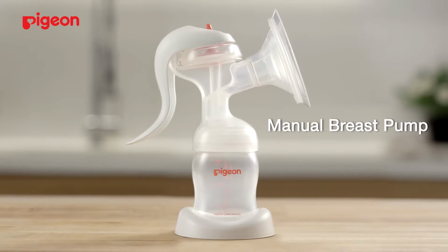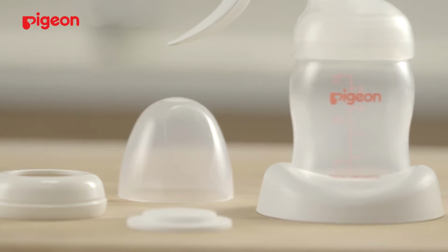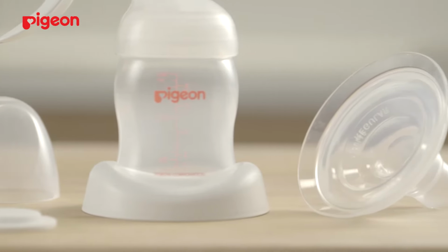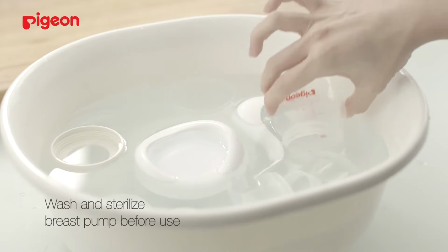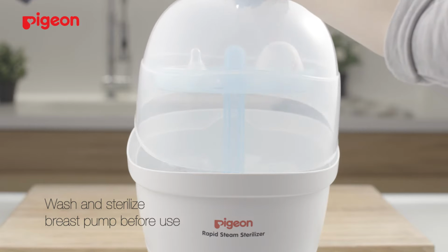Breastfeeding is a beautiful part of life, but you may feel overwhelmed looking at all the parts. Follow these few simple steps and you'll be good to go. Before use, wash and sterilize the breast pump first.